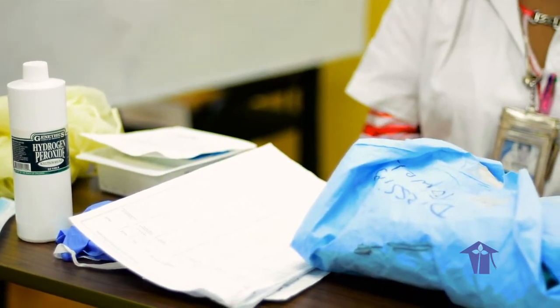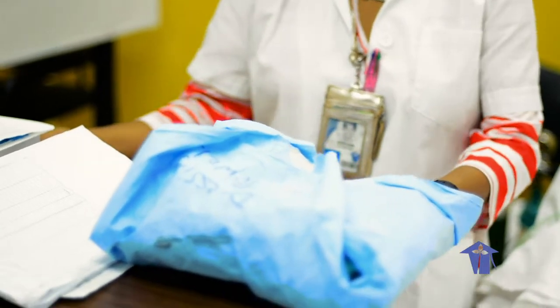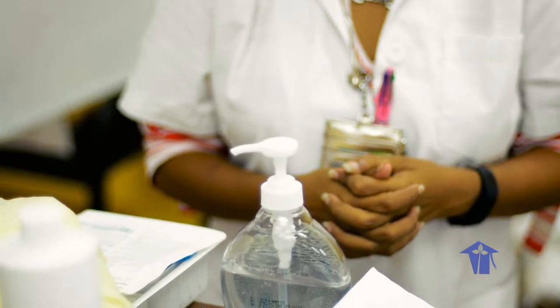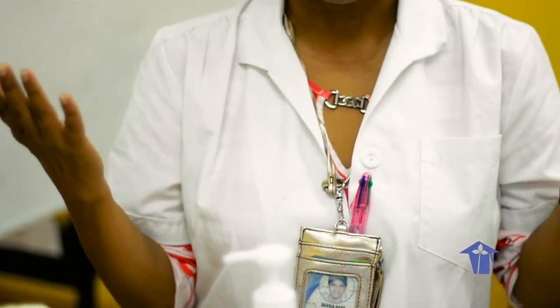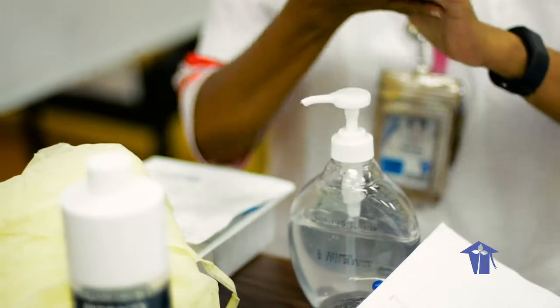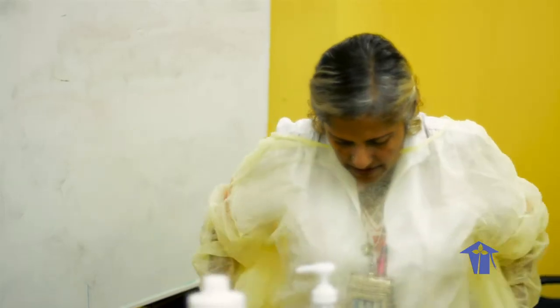You will bring all the necessary equipment to your bedside stand or over bed table, perform hand hygiene and put on the PPEs if indicated. I already washed my hands at the sink, but I am going to use some antibacterial sanitizer as well. PPEs are being placed on.